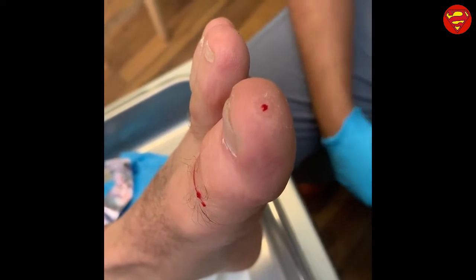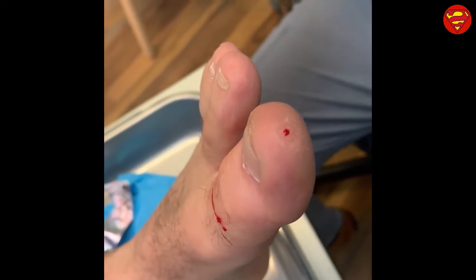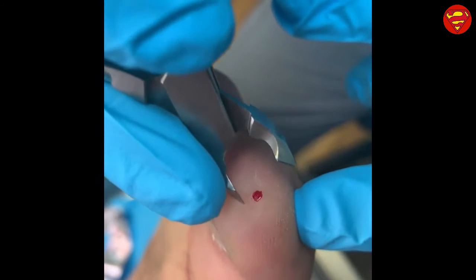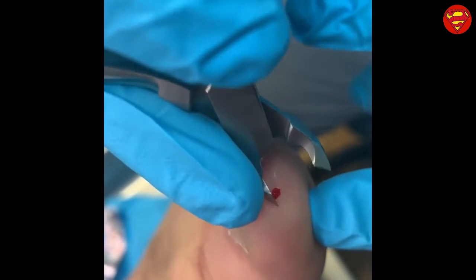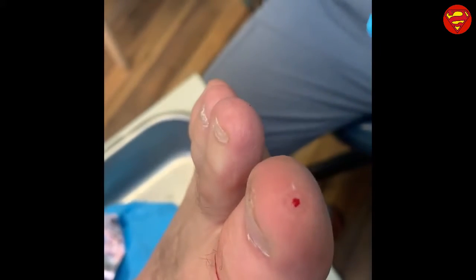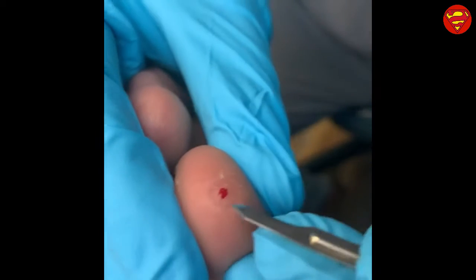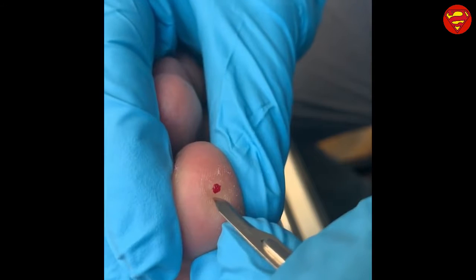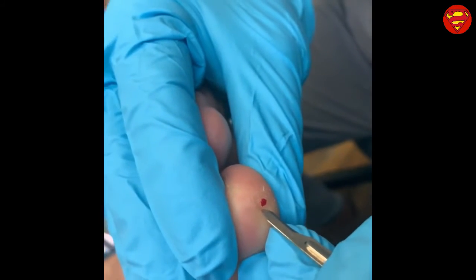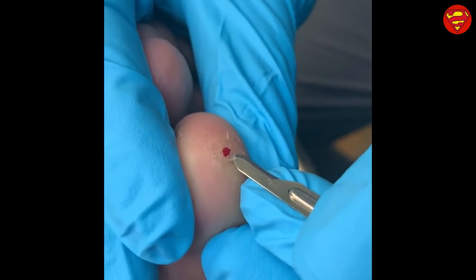So without further ado, we're going to check to make sure he's numb, and then we are going to proceed with the procedure. So this is not going to cut you. This is sharp, but it's not going to cut you. Just let me know if you feel anything sharp. Anything sharp? No. Okay. Now, people have done that to me, and I've been surprised because they actually scream. No, I didn't feel it. Good. All right, so we're going to dive in here and see what we got. I already know where the wart is, so I'm just going to cut out that large area.